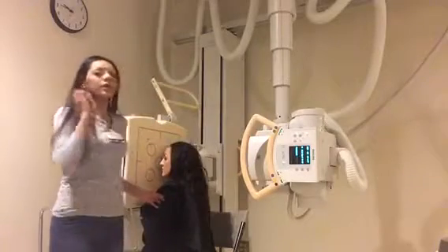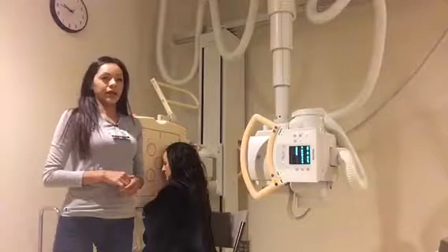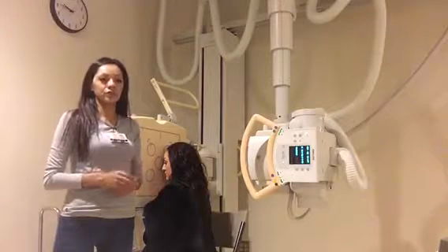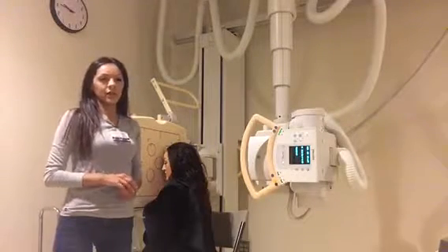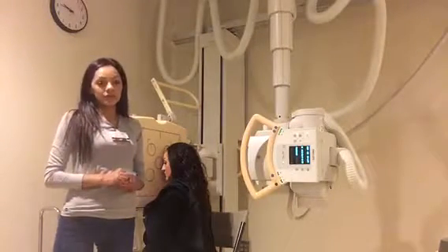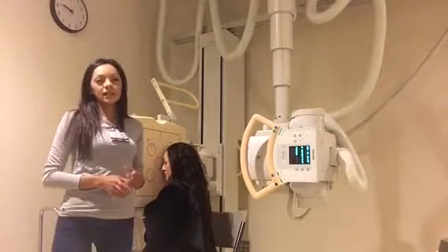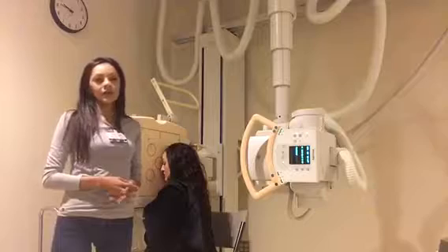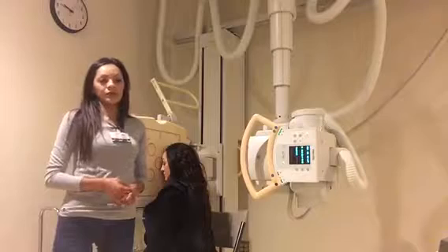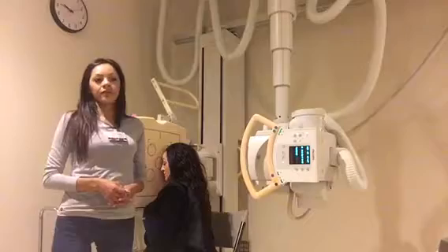So my first projection is going to be my lateral projection, and my central ray is going to be a half an inch to an inch posterior to the outer canthus. I'm either going to be in an RAO or an LAO position, and for her, she's going to be in an RAO. My mid-sagittal plane is going to be parallel to the IR, and the interpupillary line is going to be perpendicular. My IOML is parallel to the front edge of the IR.